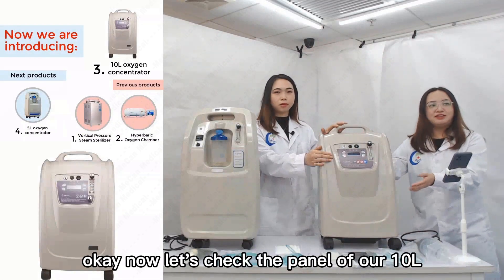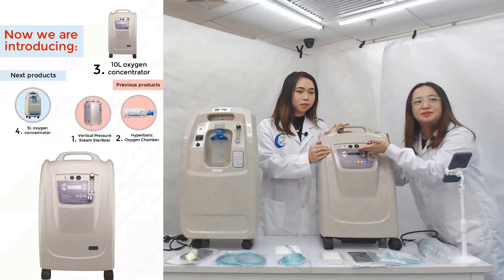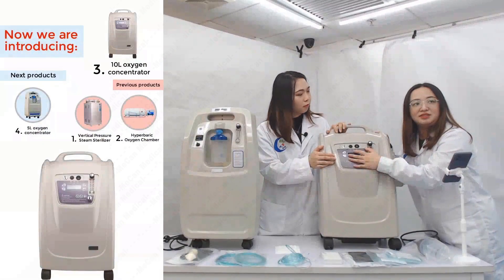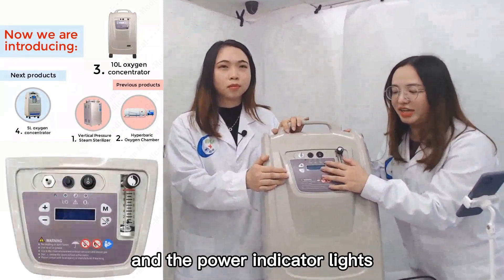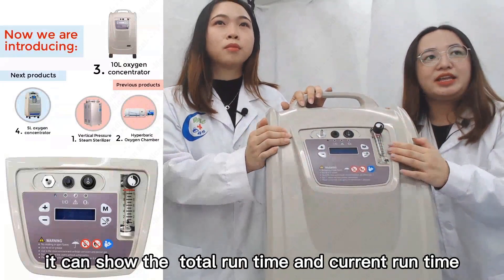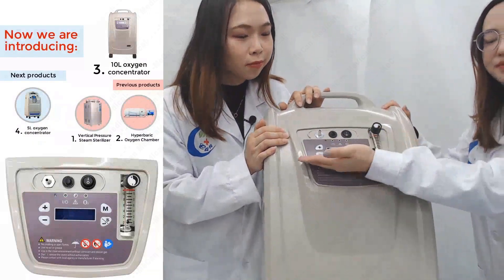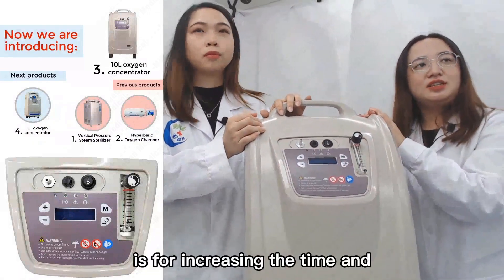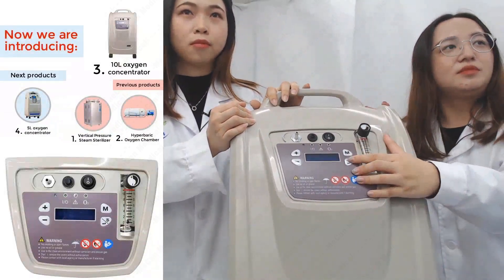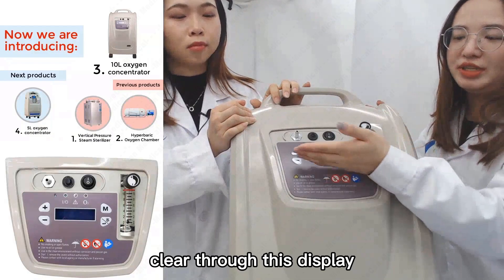Now let's check the panel of our 10-liter oxygen concentrator. For the panel, there are three lights: the alarming light, the oxygen concentration alarm light, and the power indicator light. Here is the display — it can show the total run time and current run time. There are four keys for increasing the time, decreasing the time, continuous timing, and canceling the alarm.